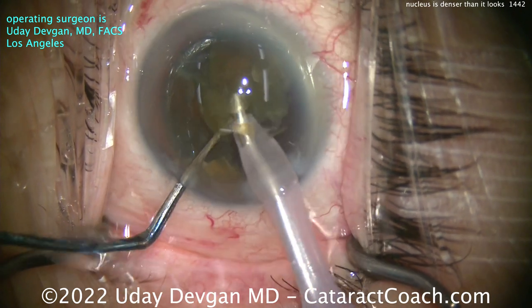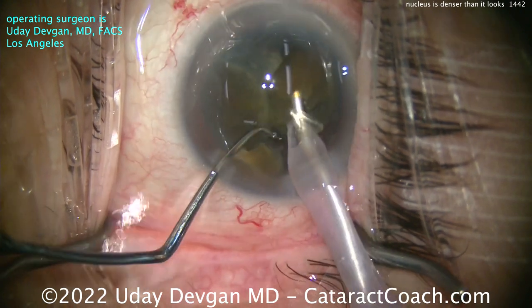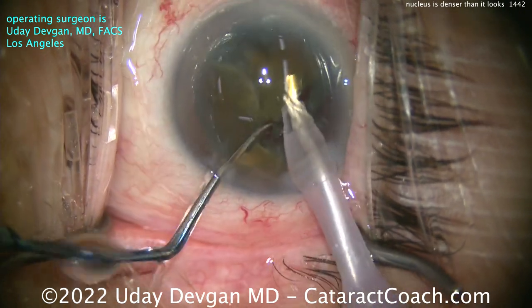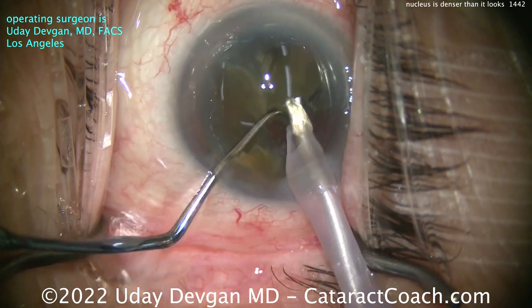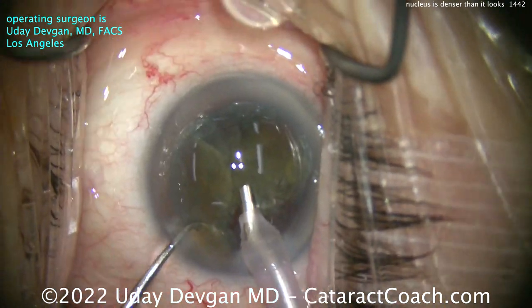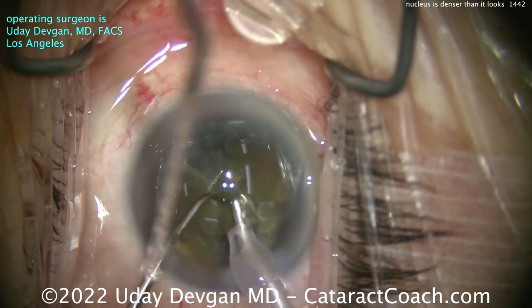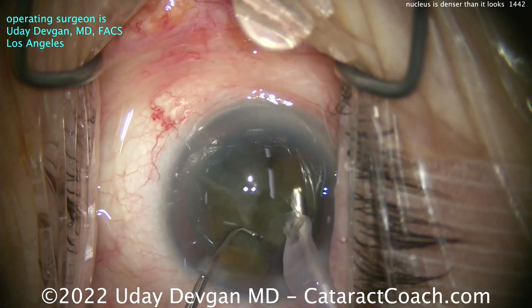Not a brunescent or dense rock of a cataract, but certainly more dense than we anticipated. That leads us to our important take-home lesson: you just have to be prepared to take the case as it comes. Don't be complacent — pay close attention so that you can adapt your technique and style to the actual case as it presents itself.